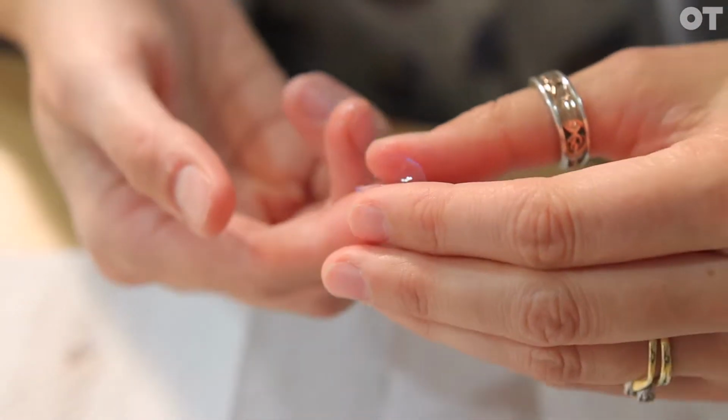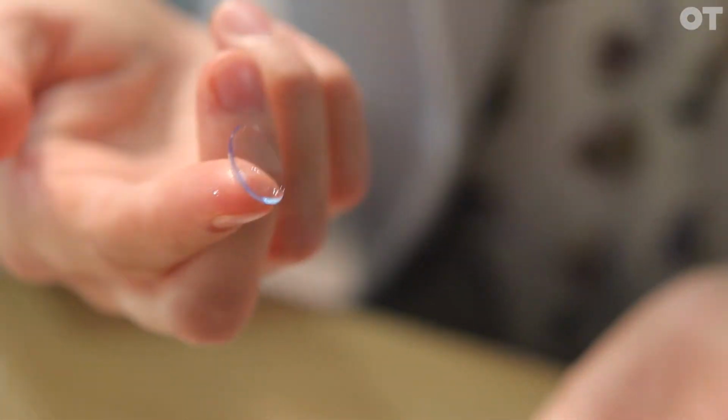If someone's hesitant about contact lenses, probably the easiest way to allay their fears is to open one up. Let them touch it, show it to them. A lot of lenses are soft and squidgy, let them handle it. Maybe put it on the end of the finger and close their eyes and say, well, can you feel it? And then they'll notice, well, I can feel it's there, but it's not going to be uncomfortable. So explain how it's going to feel. And actually a lot of the time you won't feel it at all, which is the point.